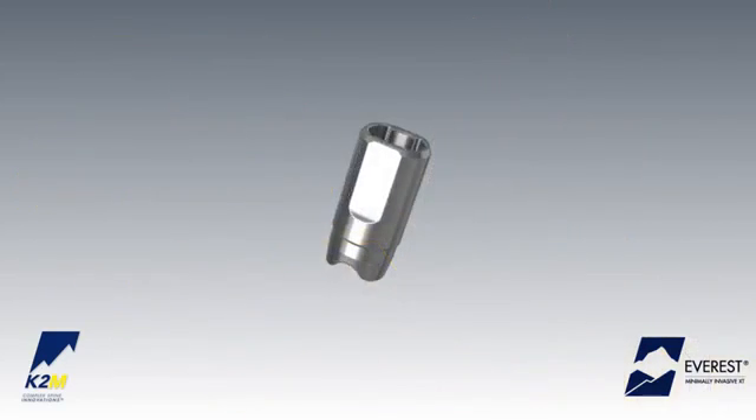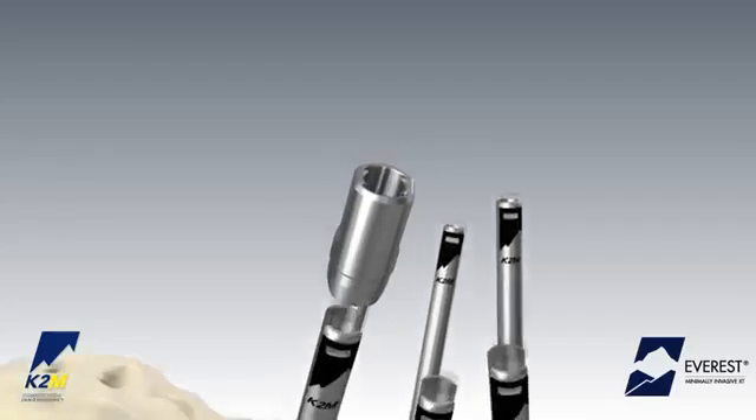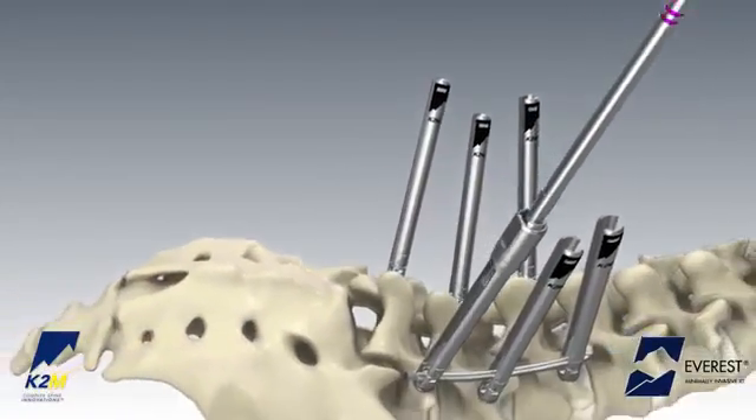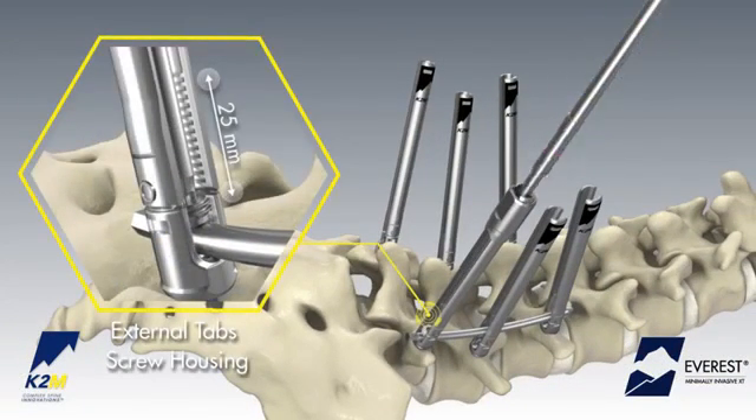For an open tab construct, use screw caps to facilitate set screw insertion and rod reduction. Place the screw cap on top of the open extension tabs. Insert the set screw through the screw cap and down the extension tabs into the implant housing until the rod is secured within the tulip.